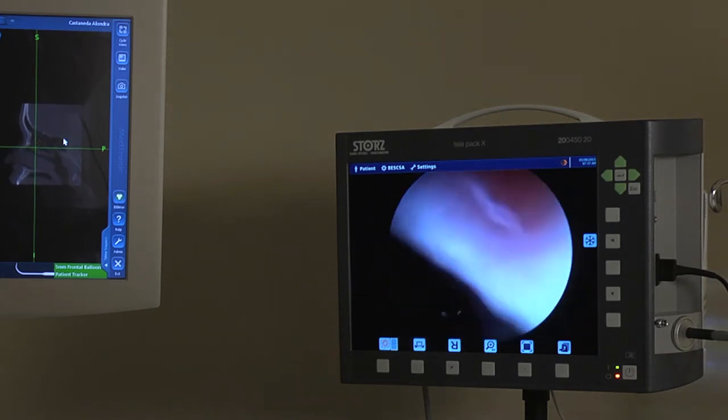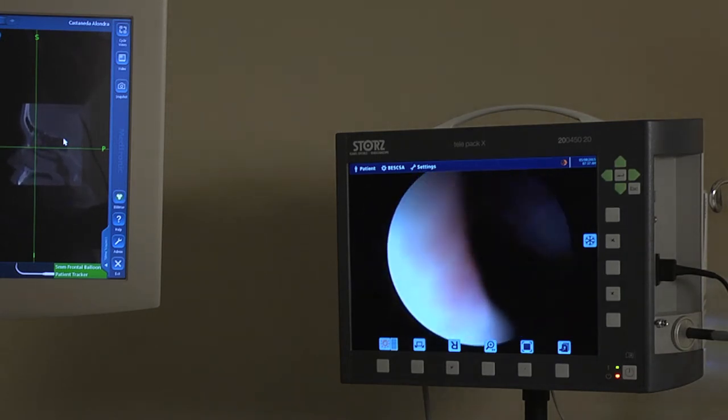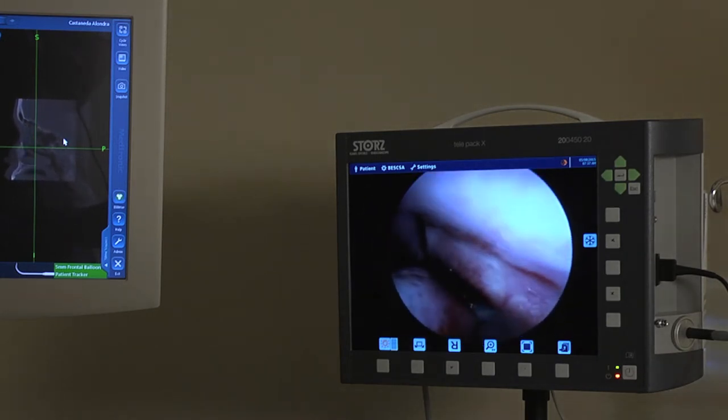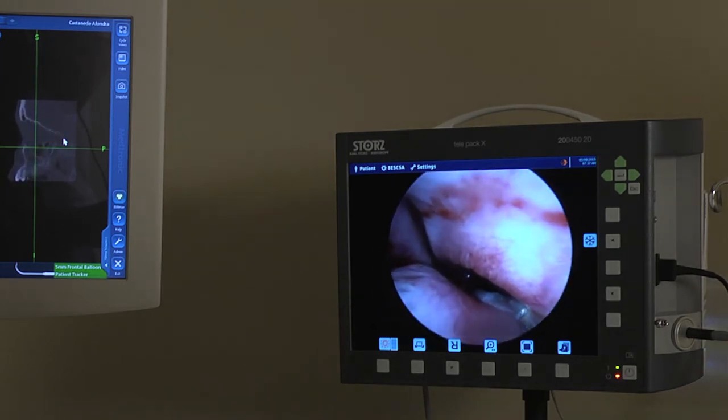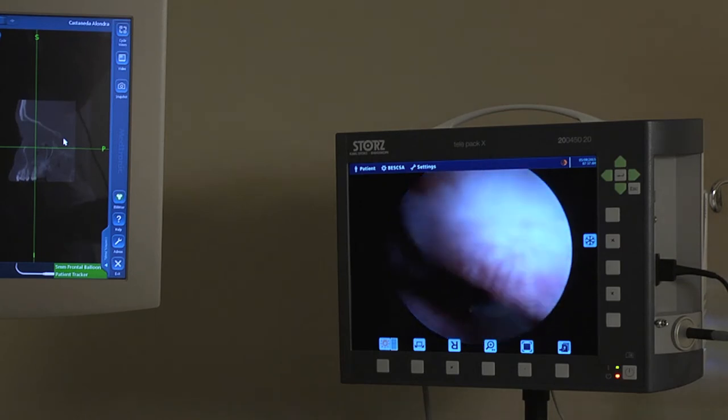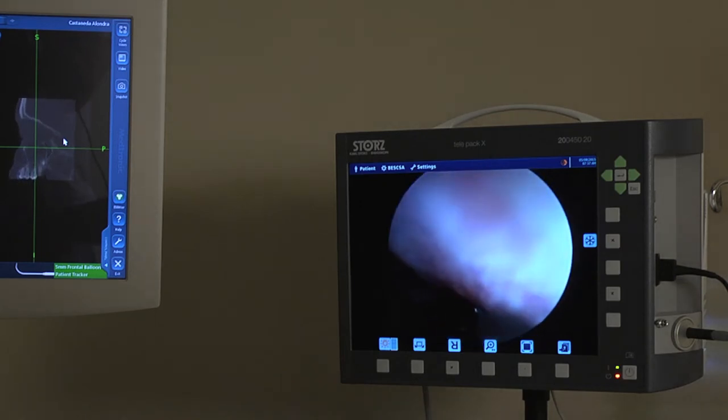Again, we'll come over in here and try to find the natural osteum. She's got a lot of infection in this one. We're probably going to have to come back at the end.